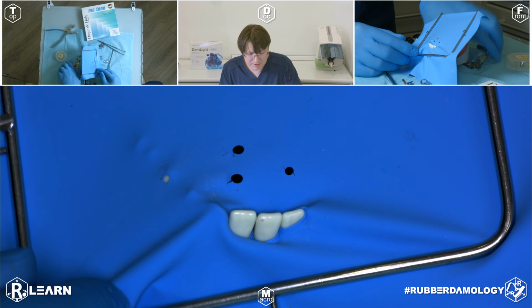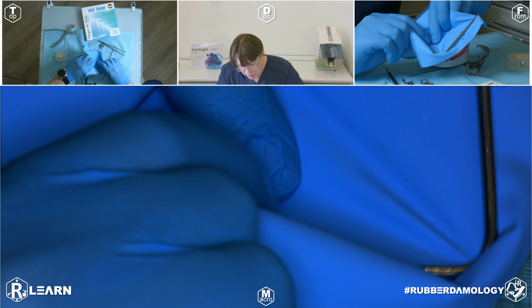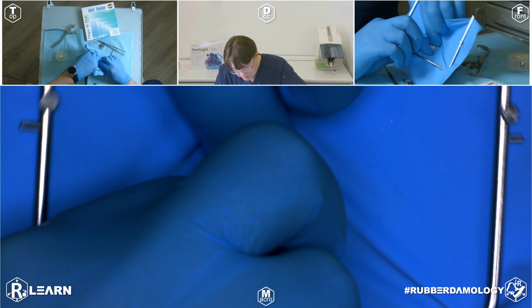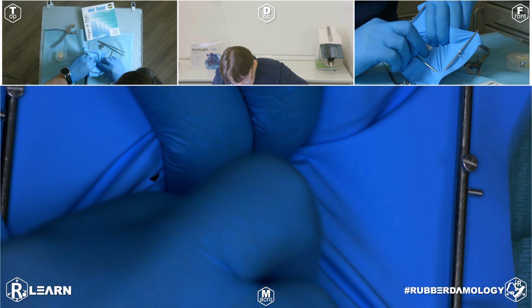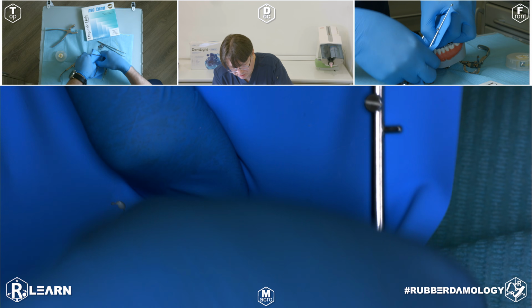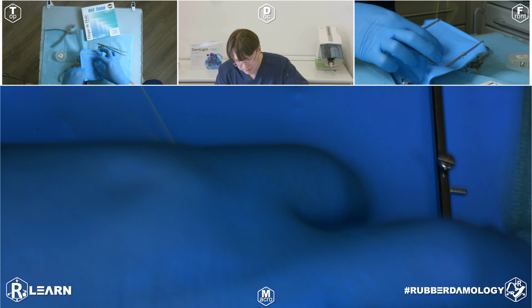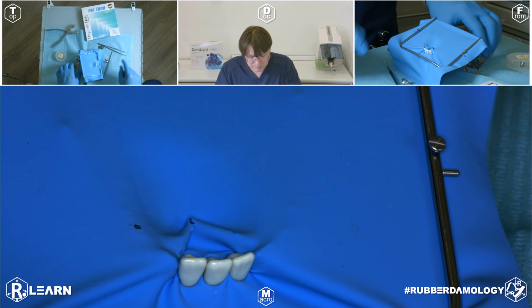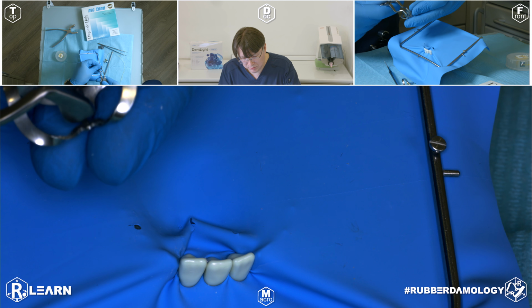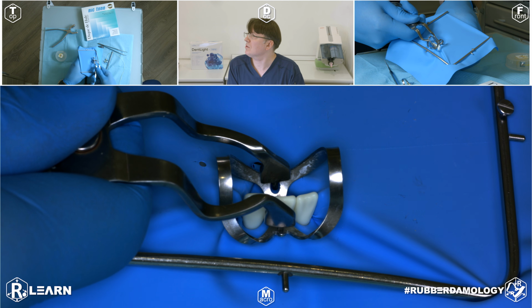The next variant, for the same tooth, the same clamp, and the same number of perforations. Maybe it's better for you, depending on your clinical situation, to apply the rubber dam to the tooth first. Make interdental flossing and rubber dam inversion. So you can check that it's very fast, and then fix your clamp and don't change the orientation of the clamp. This is the right way.